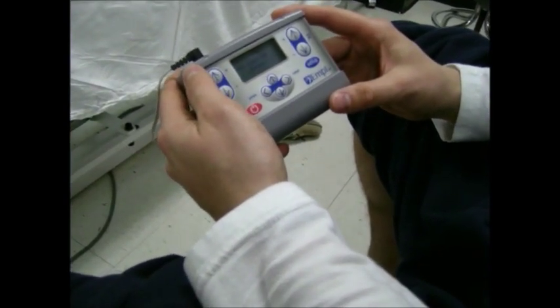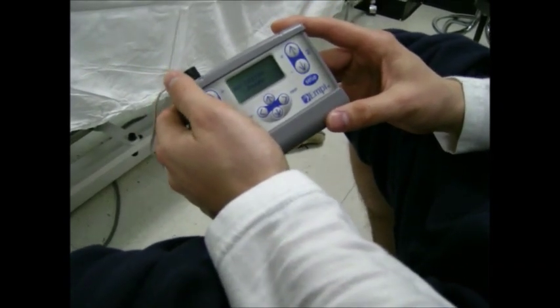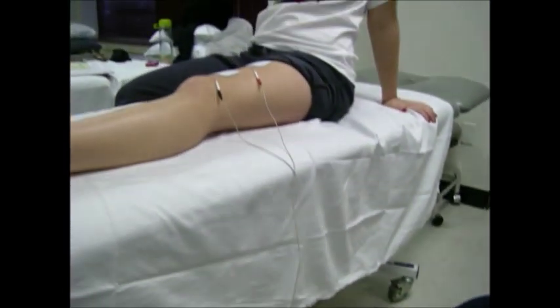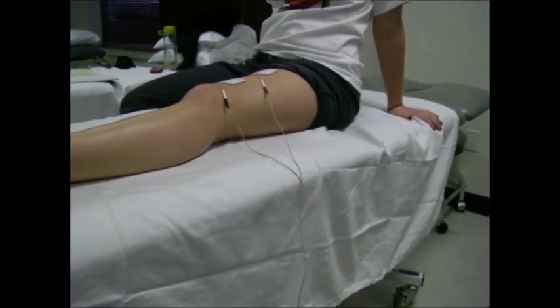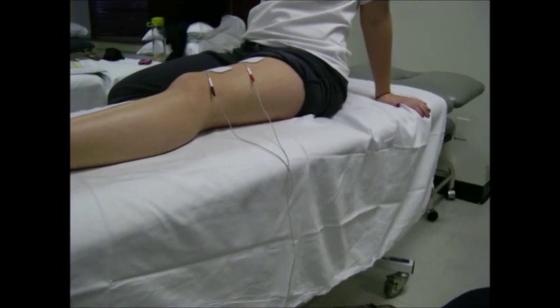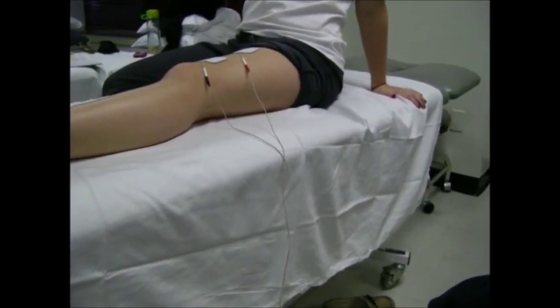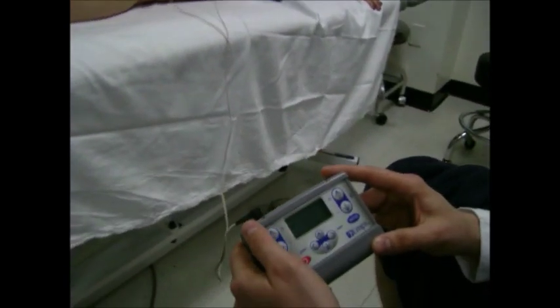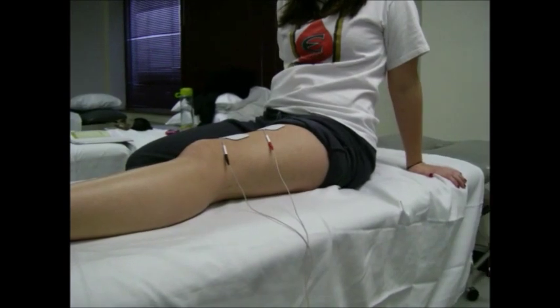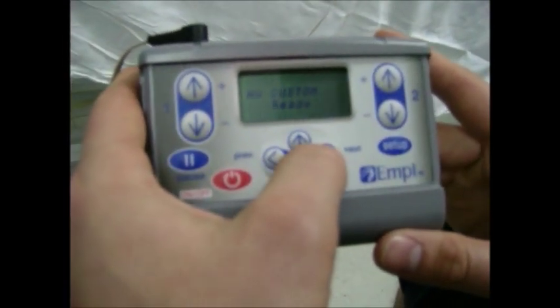We are doing the high voltage modality to strengthen the quads. We have already alcohol swabbed the leg to decrease the resistance of the skin for electricity to penetrate into the muscle, and to remove dirt and oil from the skin to decrease resistance. We have placed the electrodes on the quadriceps muscle and have done settings on our MP300.